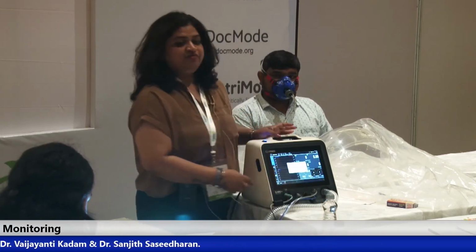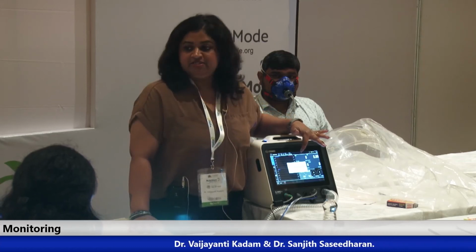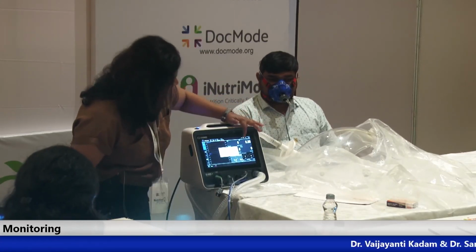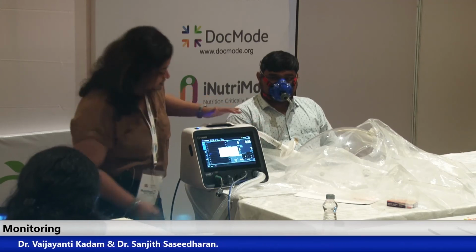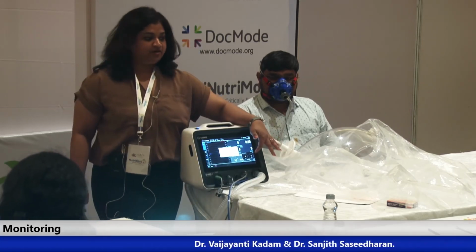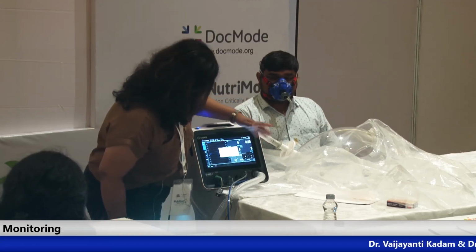So on this screen, what we are seeing here is the same thing that we are seeing over here. What we are seeing here is REE, that is resting energy expenditure. Here there is RQ again. Then there is VO2, that is volume of oxygen, and volume of carbon dioxide. Down here there are two semicircular things you can see. That is the variability, the coefficient of variation, which I said has to be less than 5%. And here the same thing, volumes.